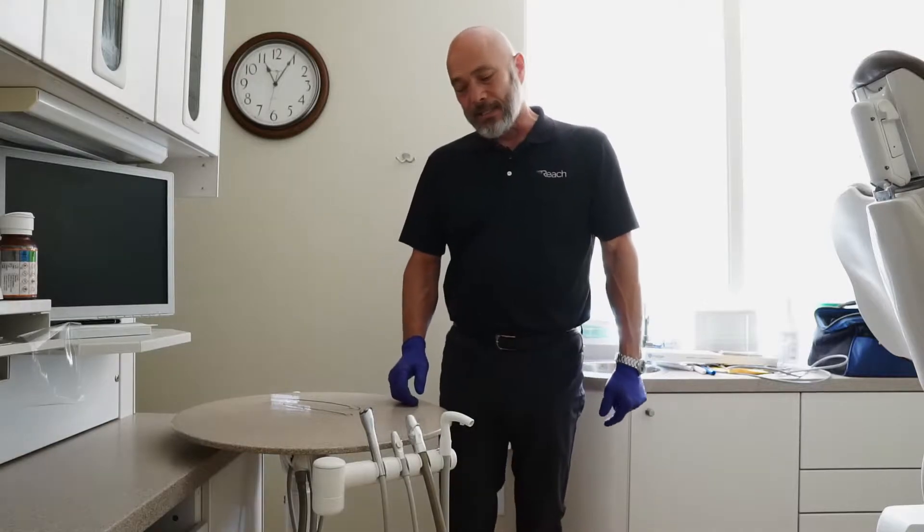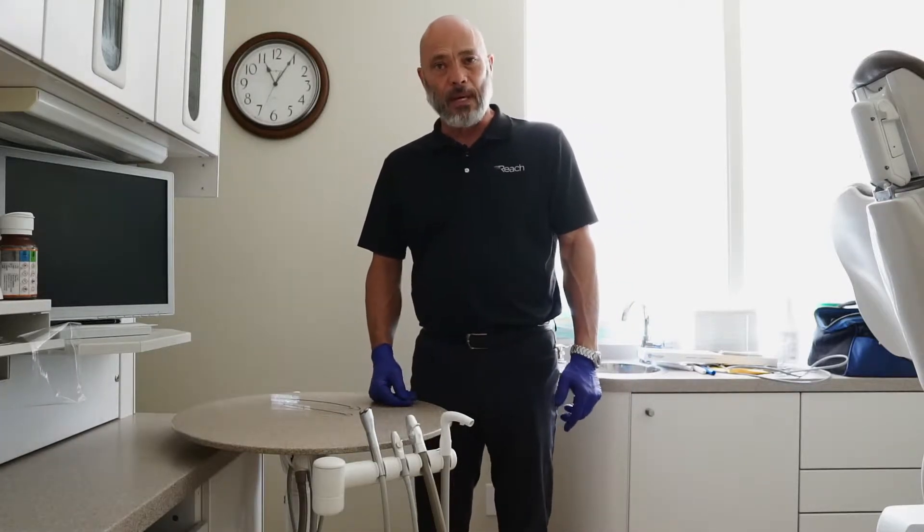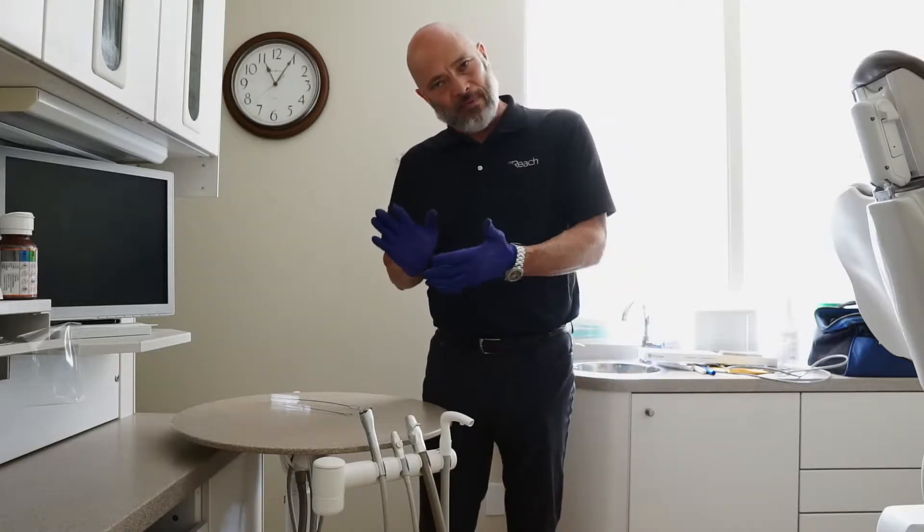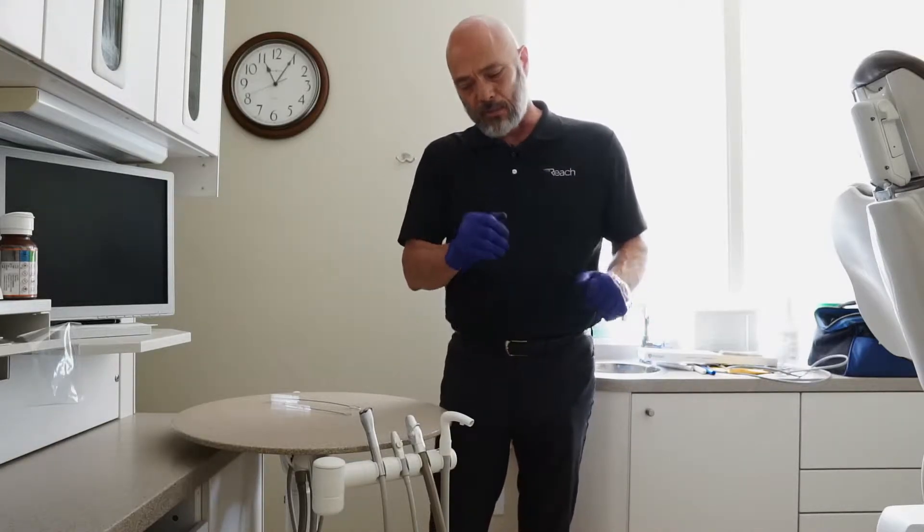Hi, welcome to Reach Tip of the Day. Today's topic is vacuum system maintenance and operation. Let's start from the very beginning and go all the way back to the vacuum pump.